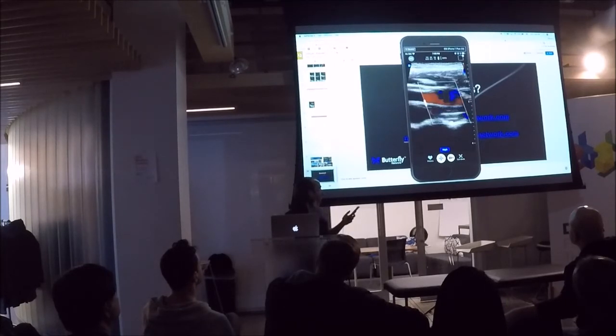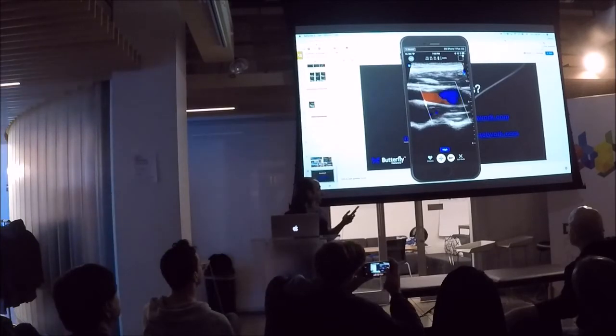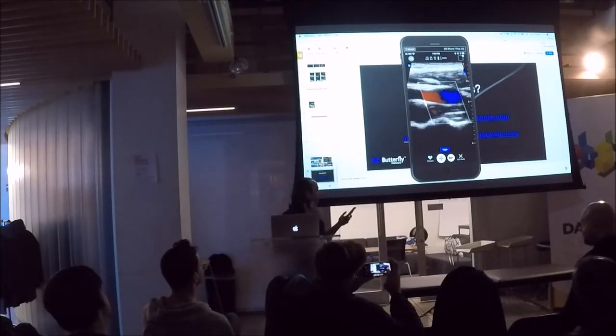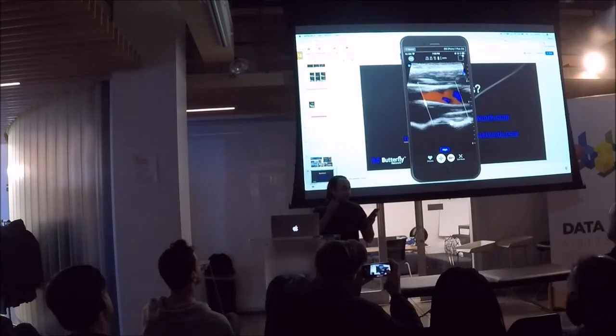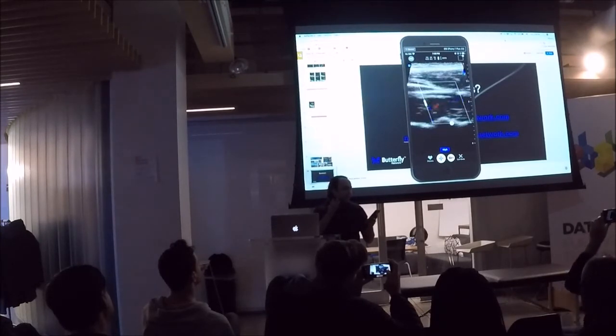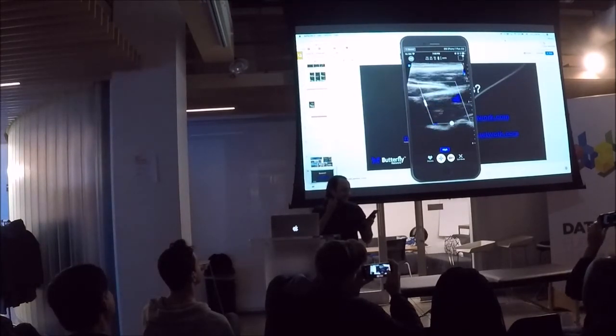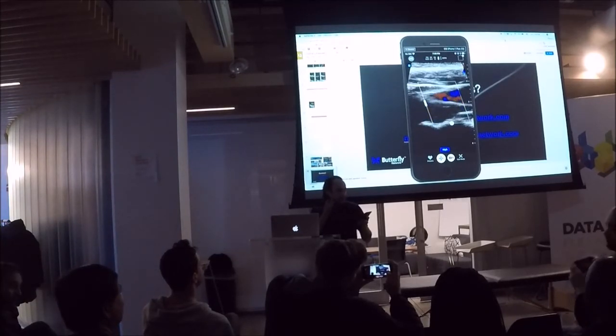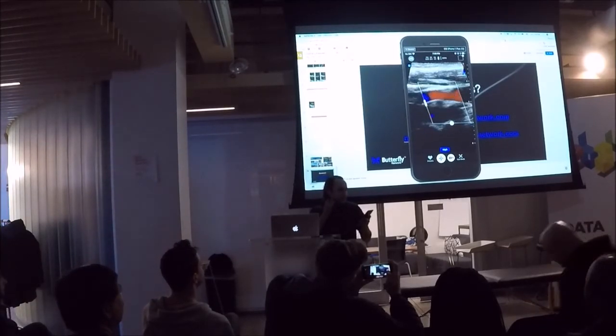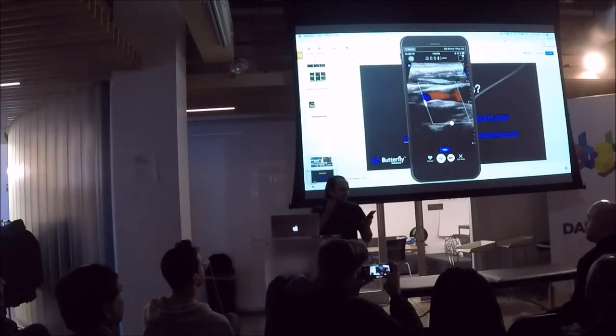And what you're seeing is the visualization of blood as it's making its way from my heart to my brain. And the two different colors indicate? That I'm a bad sonographer. It's venous or arterial? Say again? It's venous or arterial flow? To the heart and from the heart. Oh, this is from the heart.